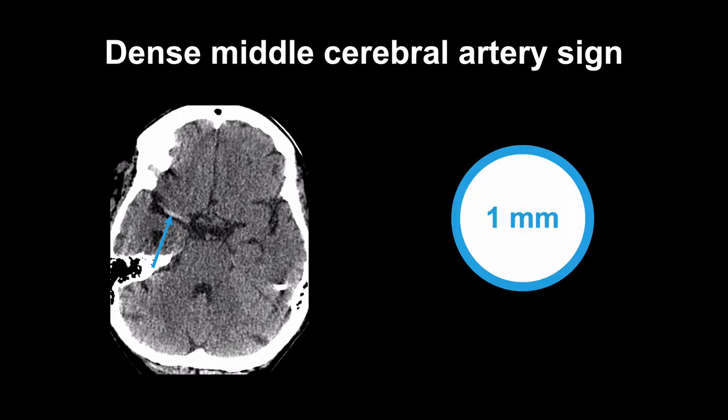This reconstruction clearly shows that the patient's right middle cerebral artery is unusually high in attenuation, and this is called the dense MCA sign. You'll have a better chance of making this diagnosis on CT when images are reconstructed at thin sections and displayed using a narrow window and level of about 40 Hounsfield units.